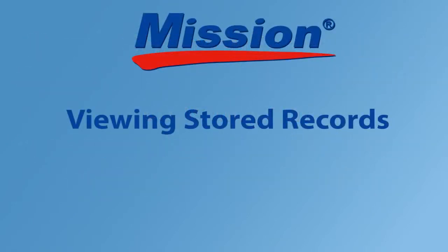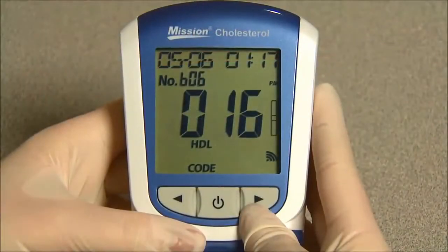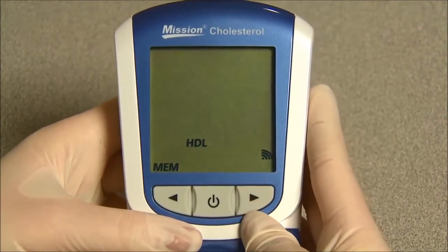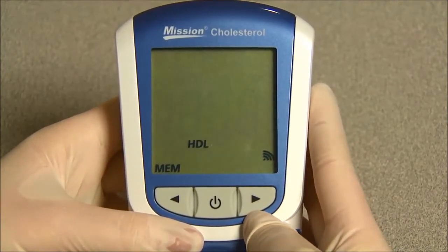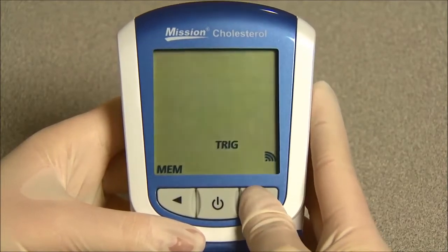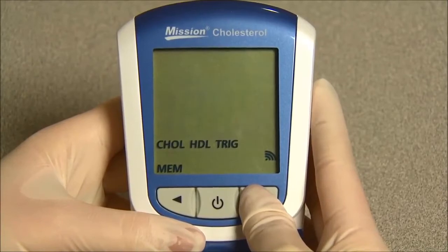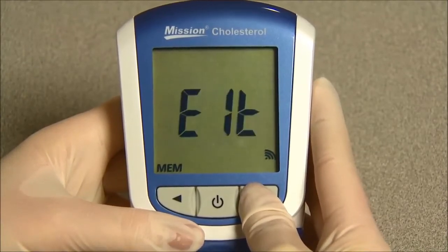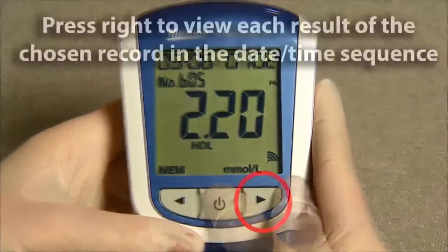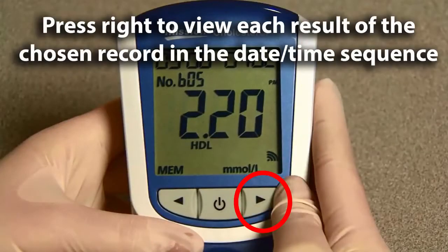Viewing stored records. To view stored records, from the initial test screen, press right or left to enter the memory database. To view the individual test results, press right or left to navigate between each record. Then press the power button to select the desired individual test. Press right to view each result of the chosen record in date, time, sequence.